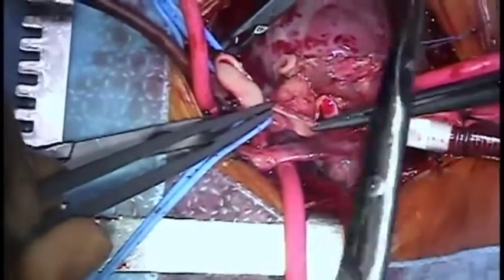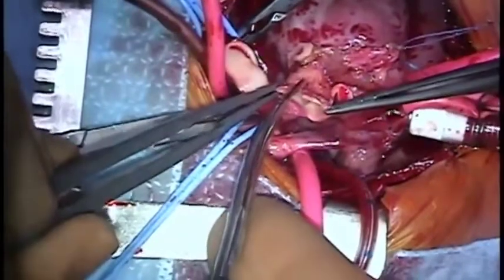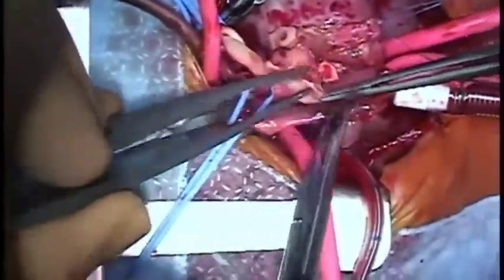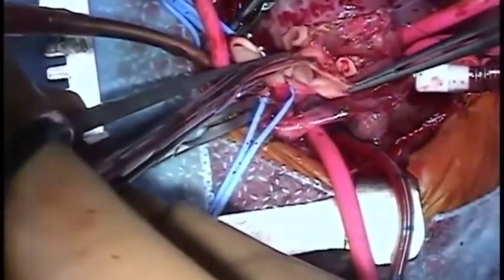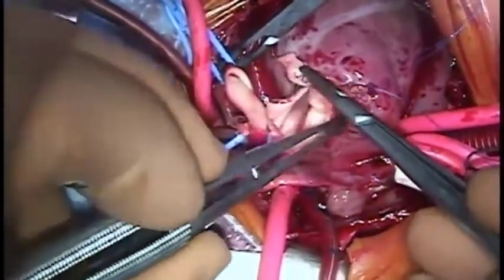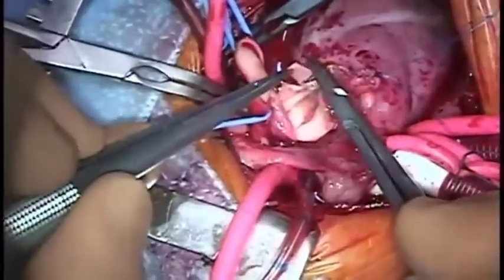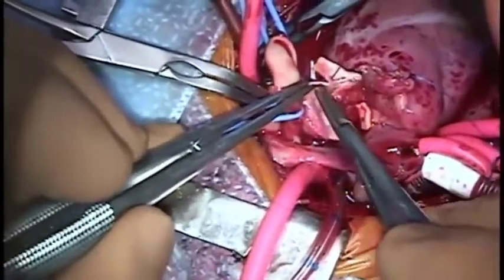A medially based L-shaped flap is cut for the left coronary button. Care must be taken not to injure the neoaortic valve. The coronary is placed relatively high to reduce the chance of kinking, but not too high that it would become stretched. When anastomosing the button to the neoaorta, care must be taken not to rotate the coronary artery. Sutures are spaced slightly further apart on the coronary than on the aorta in order to create a sinus for the coronary ostium.